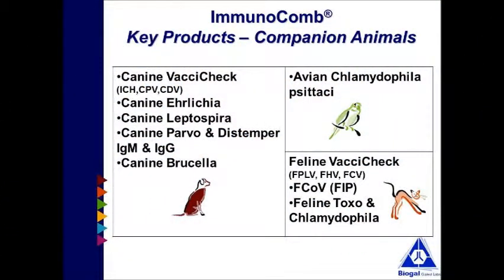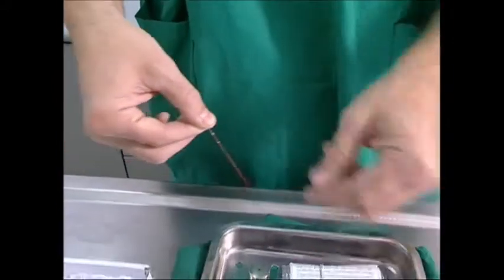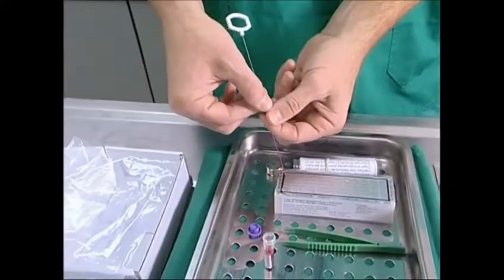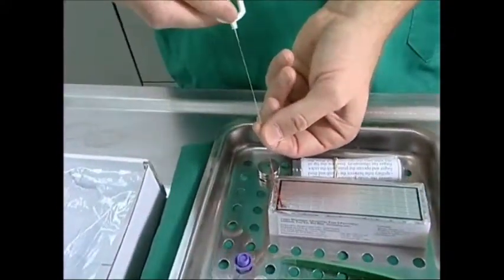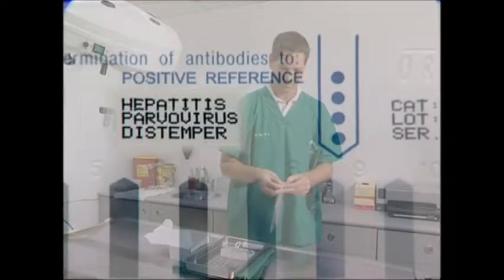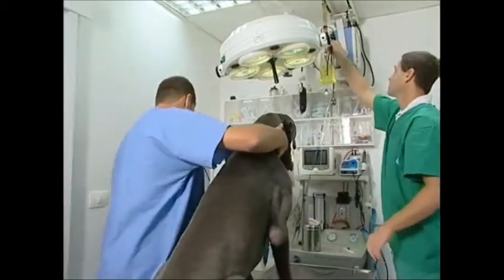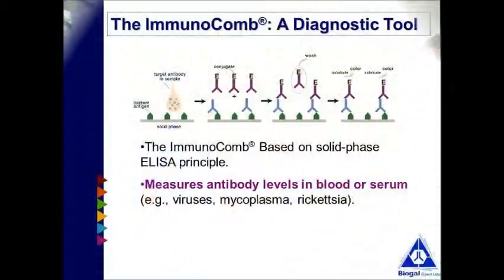In order to assist you in using the ImmunoComb antibody test kits, Biogal Laboratories have produced the ImmunoComb antibody test kit instruction video. So firstly, what is the ImmunoComb antibody test kit? Biogal's ImmunoComb kit is a quick, simple and portable dot ELISA based test. The ImmunoComb provides quantitative, semi-quantitative and qualitative results.